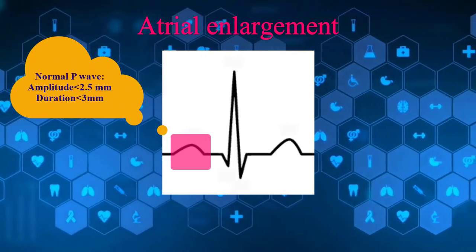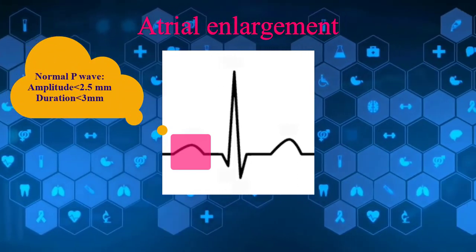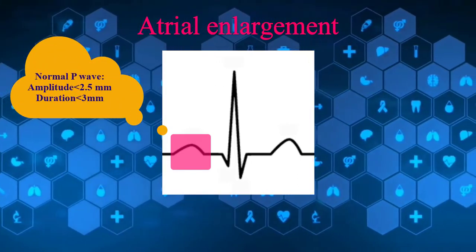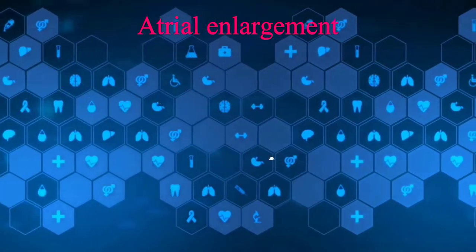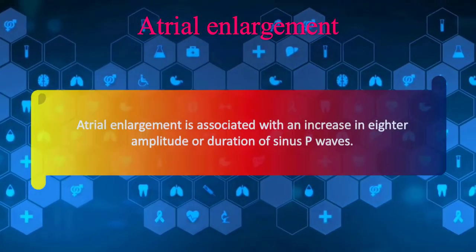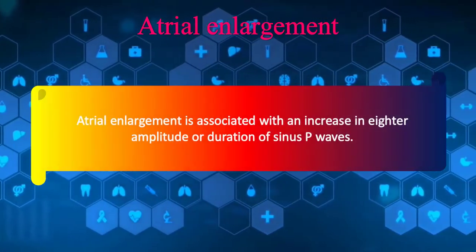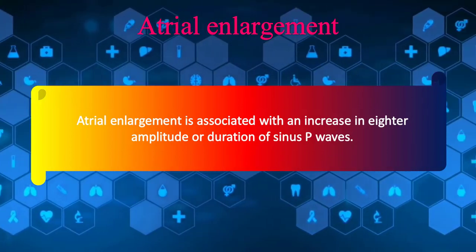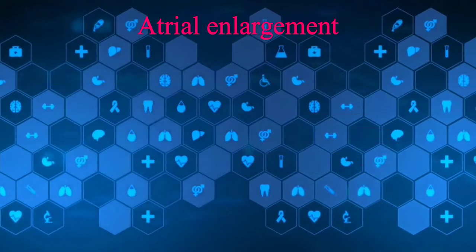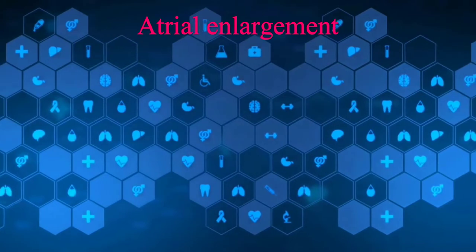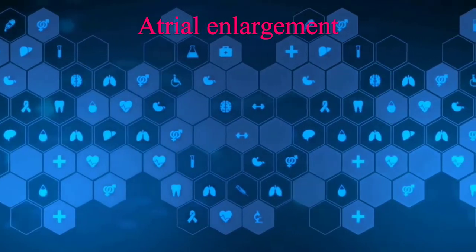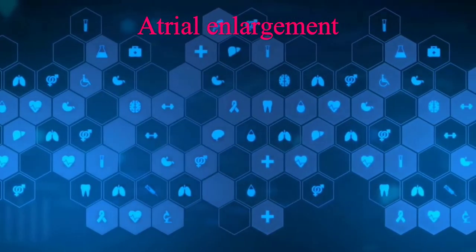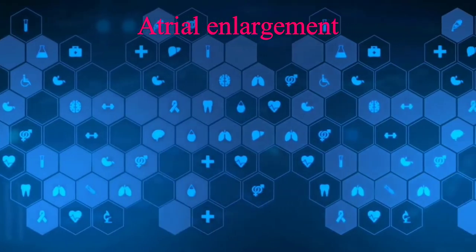The amplitude and duration of sinus P waves are normally less than 2.5 and 3 small boxes respectively. Atrial enlargement is associated with an increase in amplitude or duration of sinus P waves. Like many cardiac abnormalities, several electrocardiographic criteria for diagnosing right and left atrial abnormalities are defined.